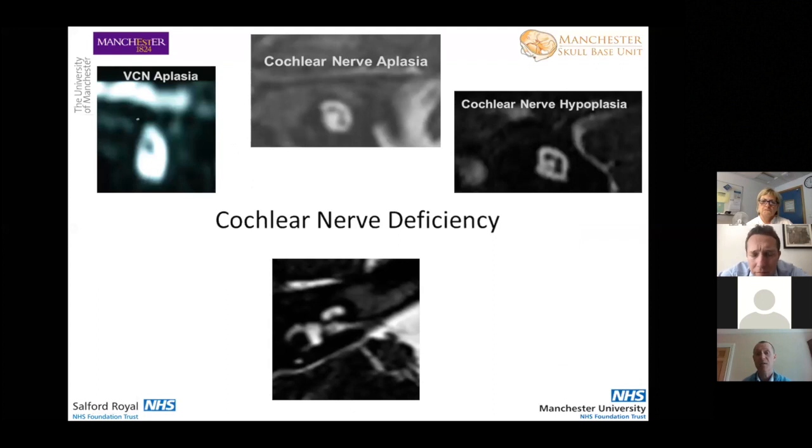Yeah, absolutely. So if we take the cochlear patency, for example, we know that some of those meningitis cases have a complete whiteout on their signal, and sometimes we'll try drilling out that basal turn, but if there's nothing visible on the scan, then they're unlikely to get a useful outcome.